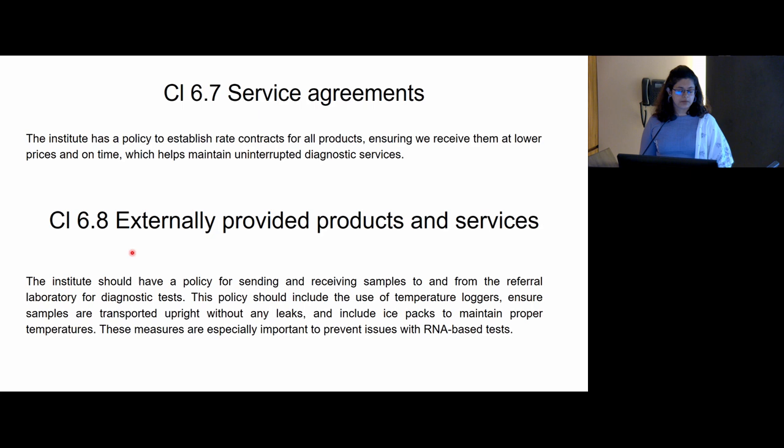Hence, the institutes at both ends have a policy to transport the samples, like use of proper temperature loggers, and they are transported upright without any leaks, including ice packs to maintain proper temperature. This is especially important to prevent degradation of RNA for the RNA based tests.